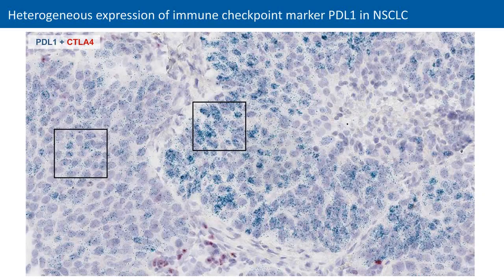In this image, PD-L1 mRNA expression is shown in green, and the two delineated tumor areas display different levels of PD-L1 expression, pointing to a heterogeneous expression pattern for this target. Also note that RNAscope shows no signal when RNA is lost in necrotic tissue with no intact cellularity, like visible on the right-hand side of this image.